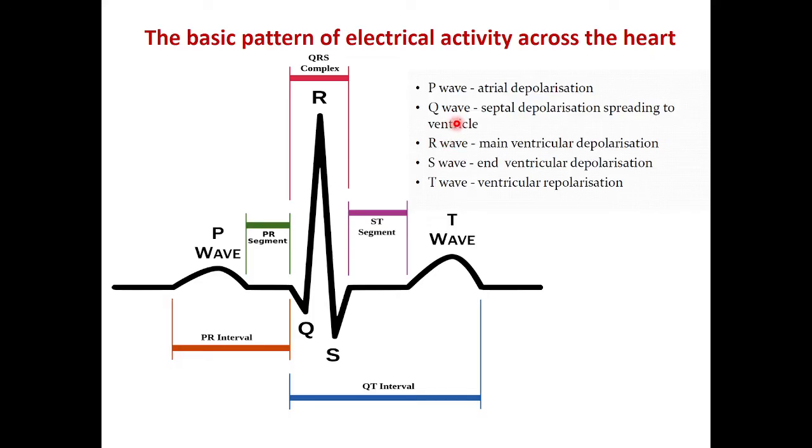Q wave is the septal depolarization, when the septum is depolarized. Okay.